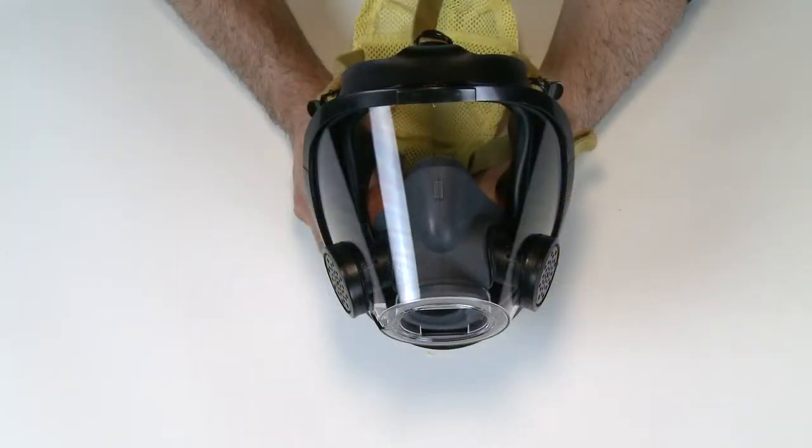The facepiece should be inspected regularly as a part of your facility's respiratory protection program. This chapter will walk you through the inspection of the facepiece and head harness.